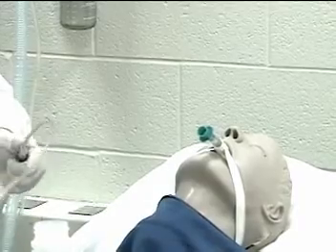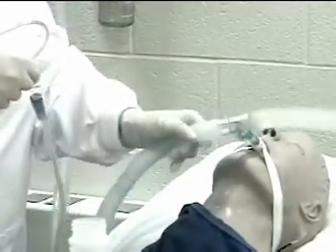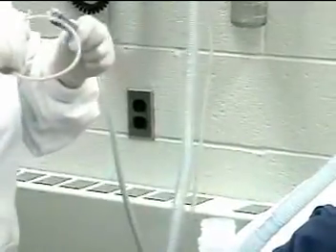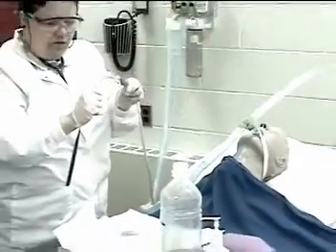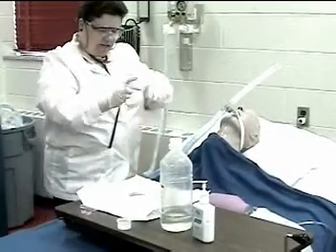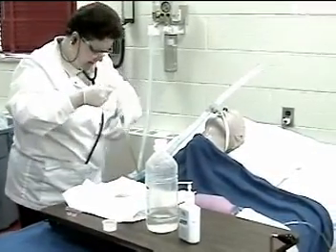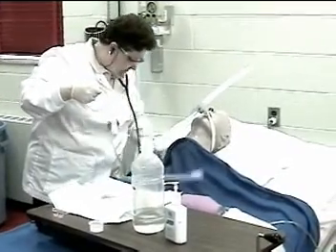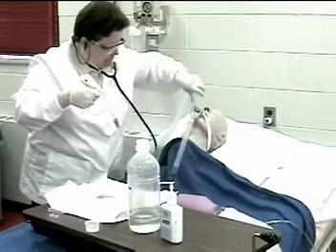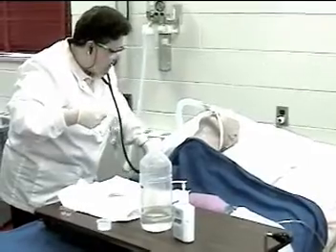Advances the catheter until resistance is felt. Suctions for no more than 15 seconds. Let me give you a couple more breaths. Notice that I have the catheter wrapped around my hand keeping it sterile. I just rinsed it out. I'm going to listen to your lungs again to see if I need to go down again.